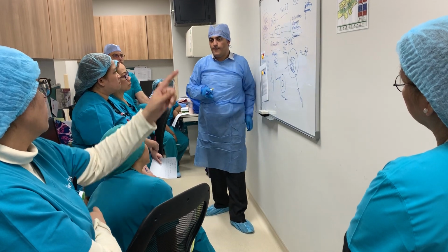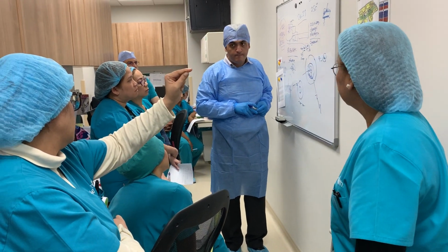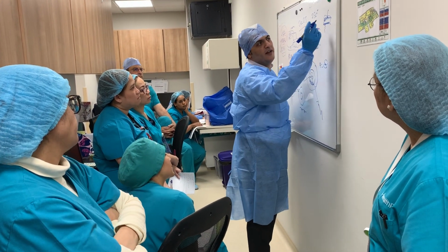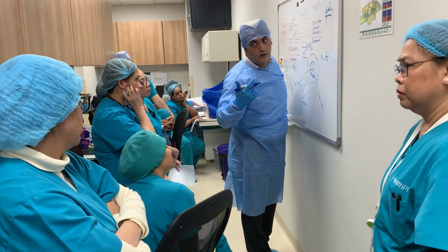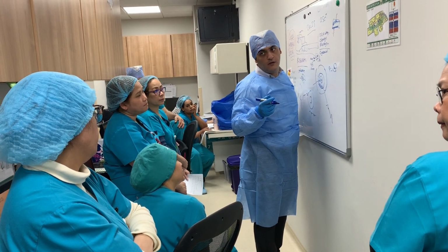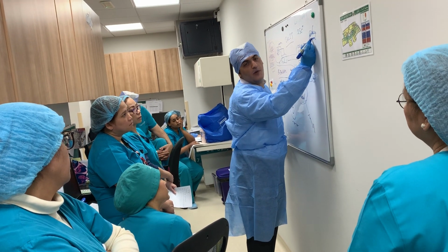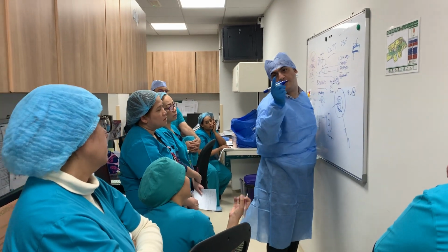Any other questions? From the tube, we will have to take only from the top, aspirate. Yes, you take from the surface layer, and if you don't find enough in the surface layer, like we are doing for the clinical case, we apply this technique for the sample. So we take from the top, not from the bottom. The bottom basically has the particles that are bound to the bad sperm.